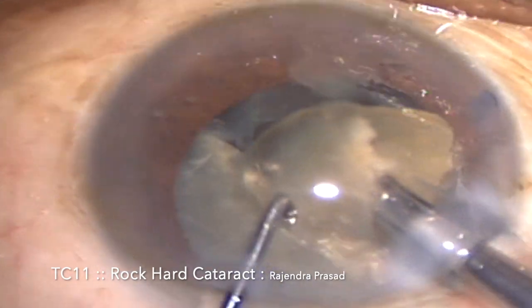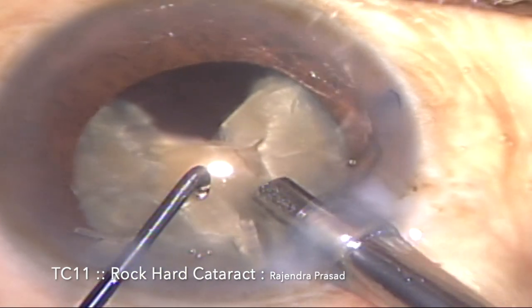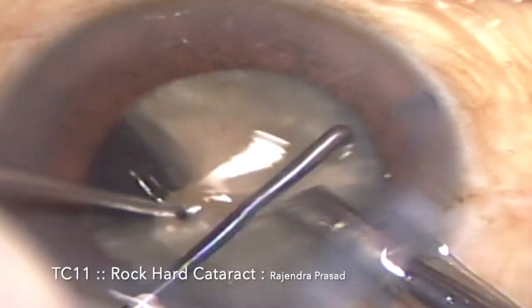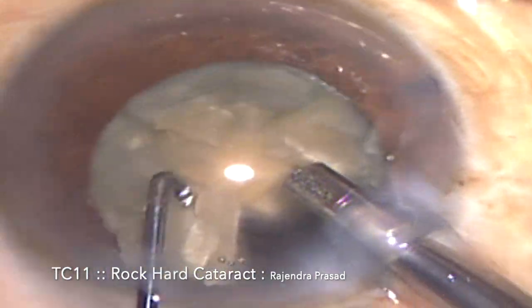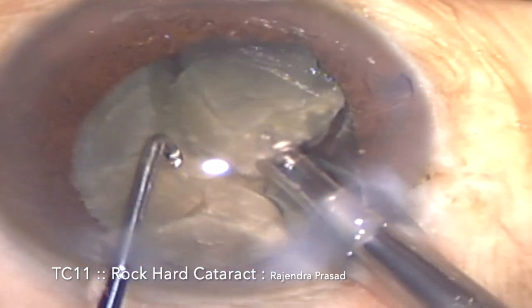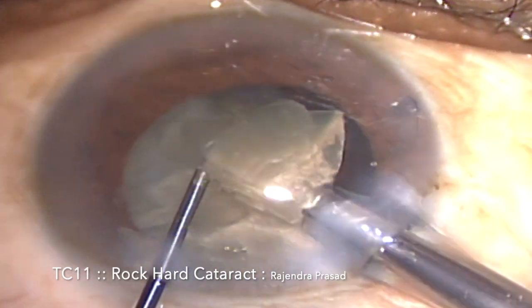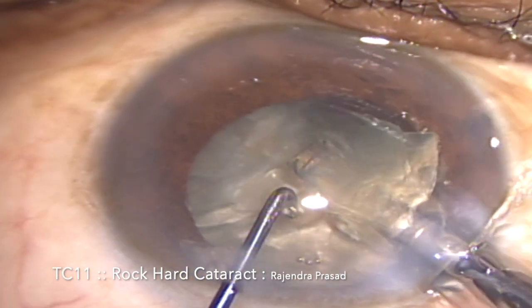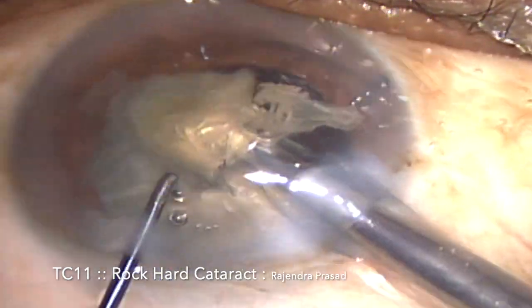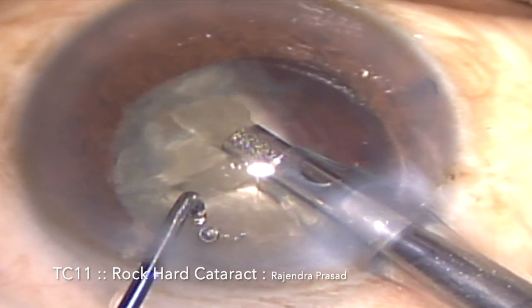So now these are three segments. I'm drawing the first segments and emulsifying. It becomes very simple because when segments are free, you don't have to do too much manipulation — too much struggle is not required. These free pieces very easily come onto the FACO probe. I'm drawing the next piece with the FACO probe and emulsifying it. To emulsify these free segments, we don't need strenuous manipulation or high FACO forces; we can emulsify them with very low FACO energy and least manipulation.